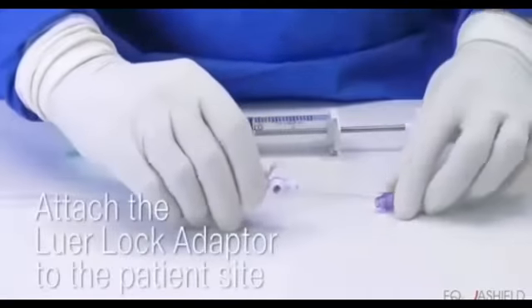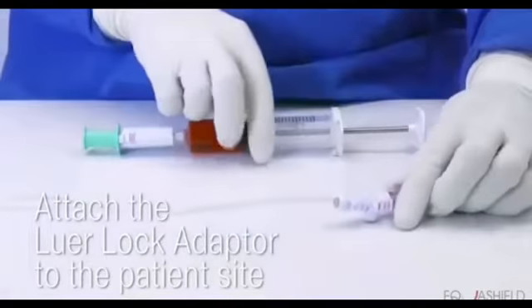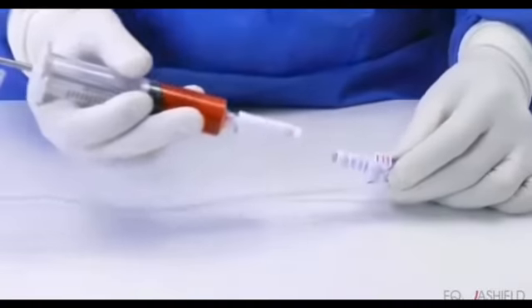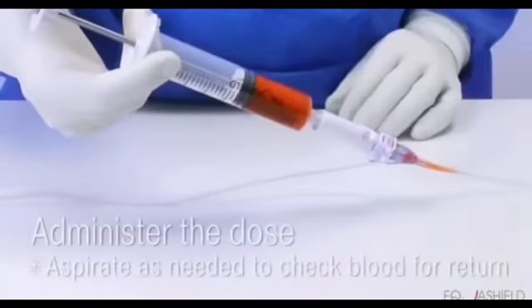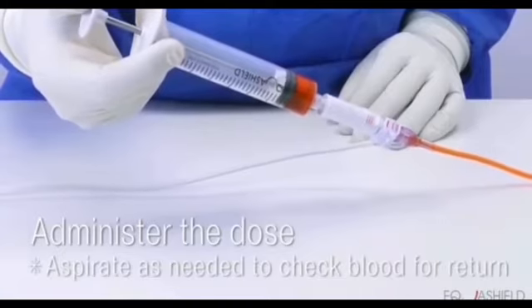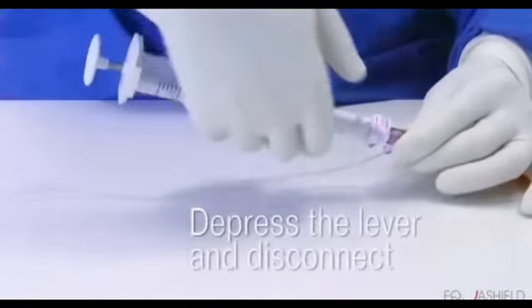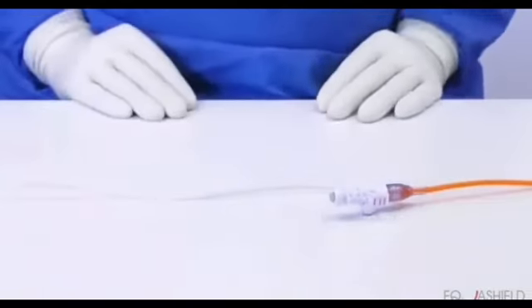IV push or bolus administration. Attach the luer lock adapter to the patient's site. Remove the protective plug, which is optional. Align red to red markings and connect. Administer the dose. Aspirate as needed to check blood for return. Depress the lever and disconnect. IV bolus administration.